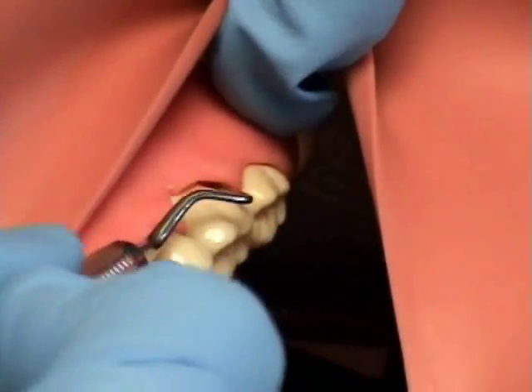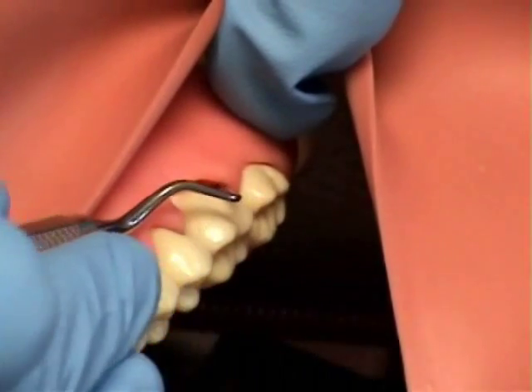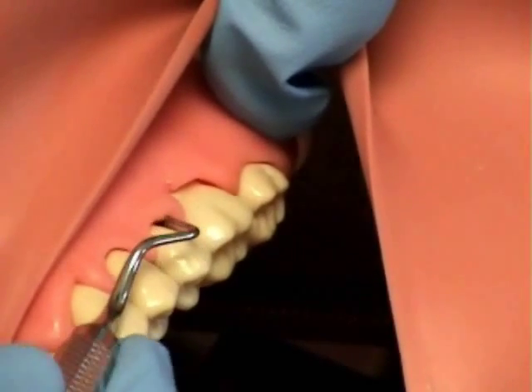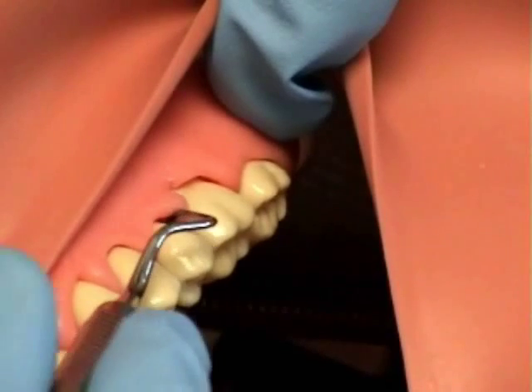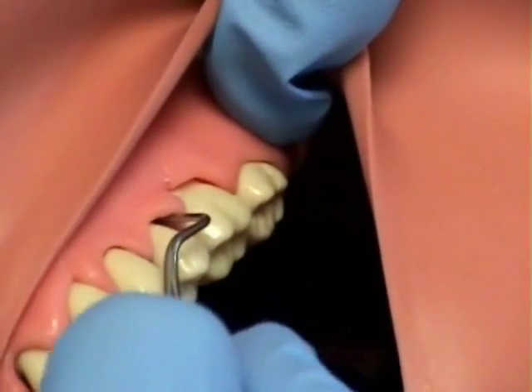The 1718 is being used on the distal surface. The extra bend in the terminal shank allows for greater access on the distal surface. The instrument is inserted at a 0-degree angle. An exploratory stroke is used to find the deposit. The blade is opened, the grasp is tightened, and the instrument is activated.